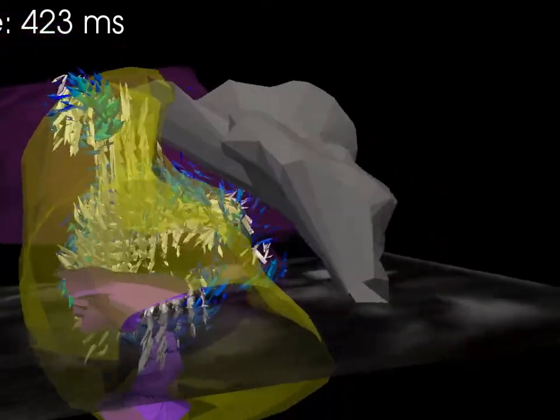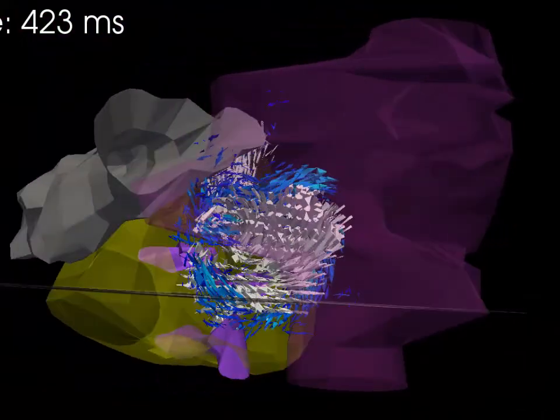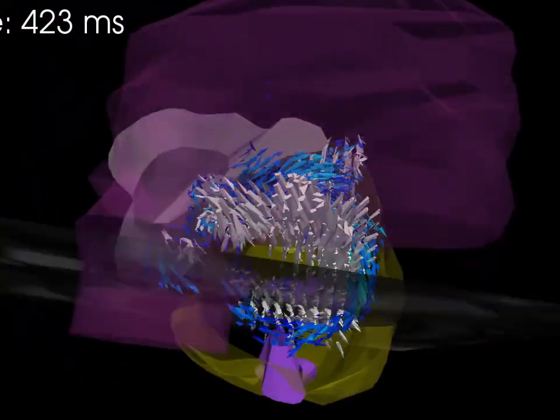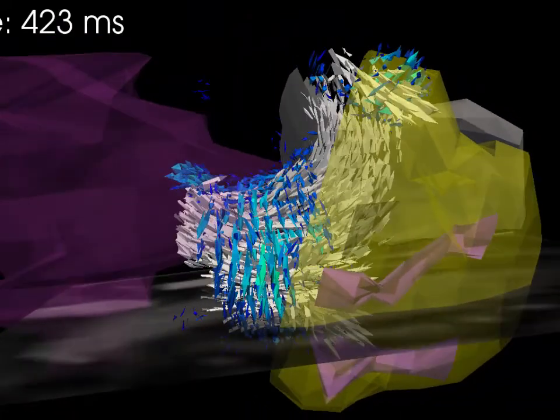Note the ring of vorticity surrounding the tricuspid flow. Note also the lack of flow recirculating outside this layer of vorticity.